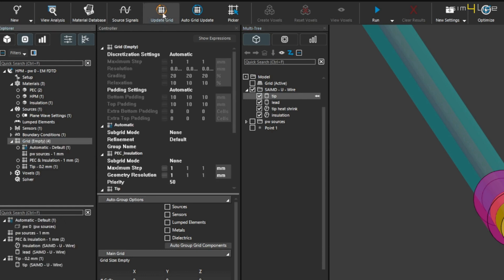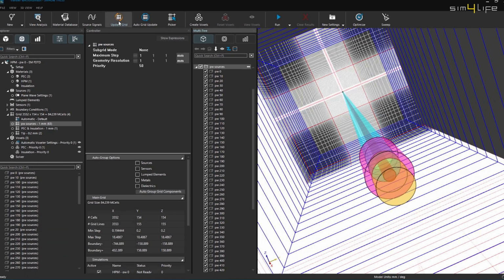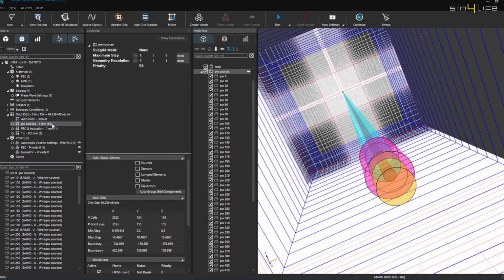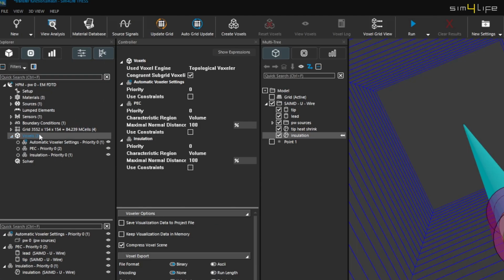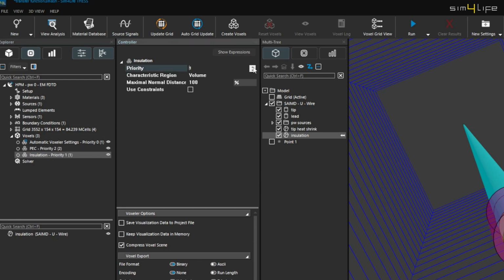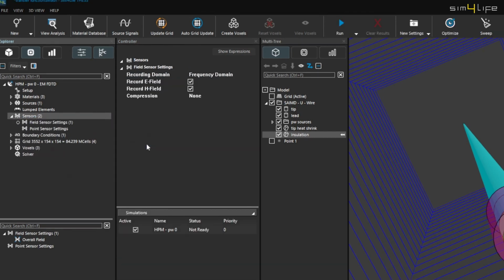To maintain consistency along the entire set of simulations, we create a common grid by dropping the PW sources folder into a new manual grid setting. Moving to the voxel settings, and to ensure that the lead is voxelized first, we assign a priority of 2. For the insulation, we assign a priority of 1, so it will be voxelized afterwards, forming a proper coating around the lead. To record the resulting electric field at the tip, we set point 1 as a point sensor.